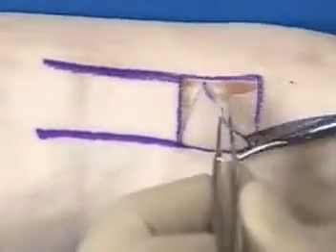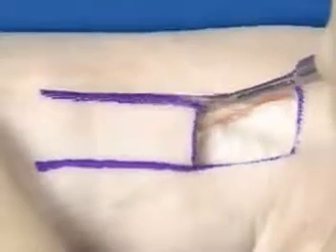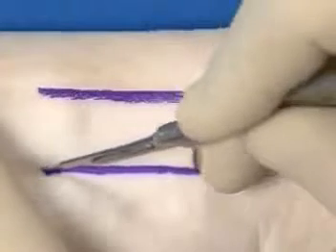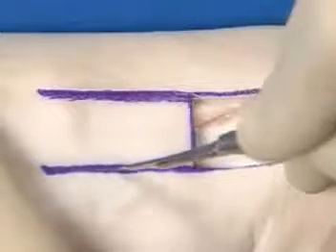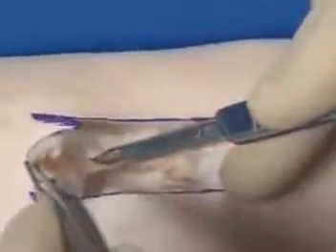The scissors can be used to undermine as well as to cut the deep layers of the soft tissues. The skin incisions themselves should be made with a sharp knife. Care is taken to incise perpendicular to the skin edges.